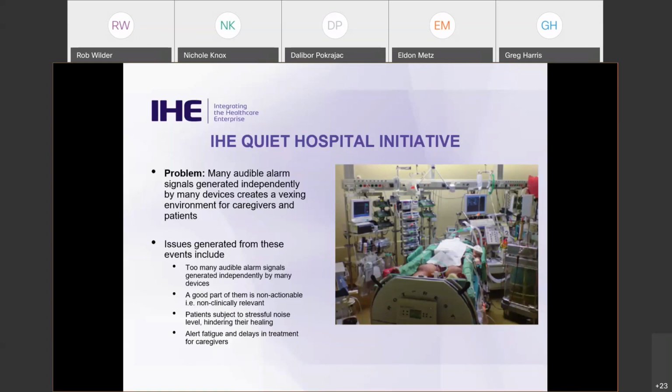So given the collaboration needed from multiple actors for a proper solution, the IHE was the right place for us to start this initiative. And given the history of cross-vendor and market-level collaboration, it's gone very well. Early research of this program by the working groups led to team-based efforts combining FHIR and HL7 2.x capabilities in the IHE standards to drive a quieter, more healing environment for patients and their families as well, along with better workflow and further diminishment of alert fatigue for the clinicians that are providing their care.